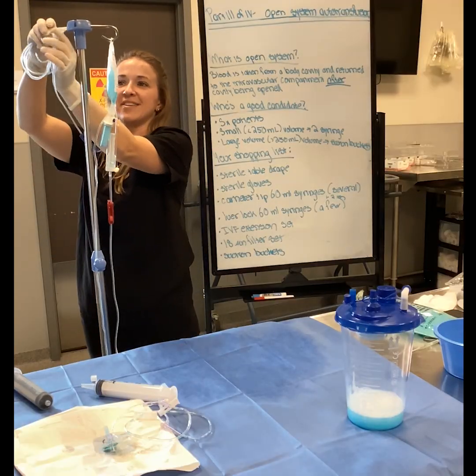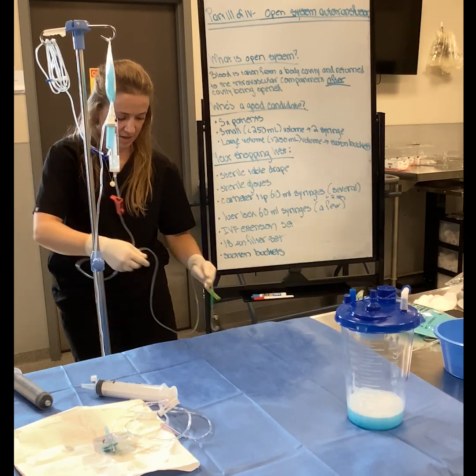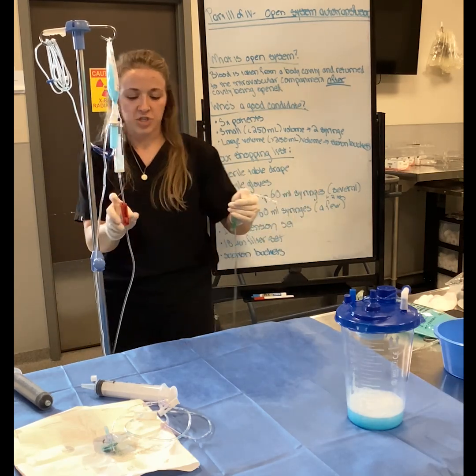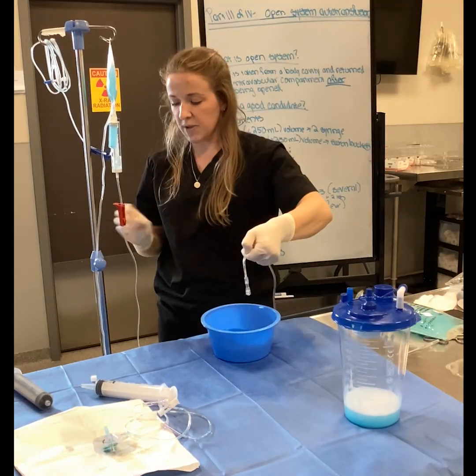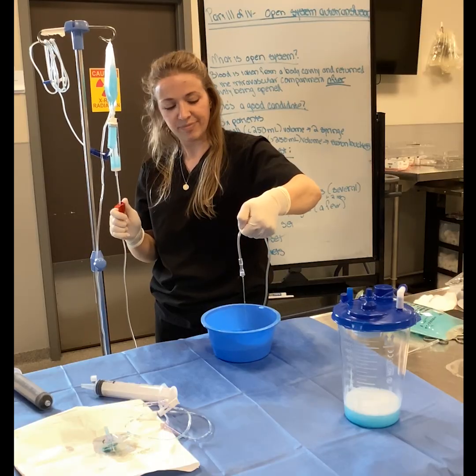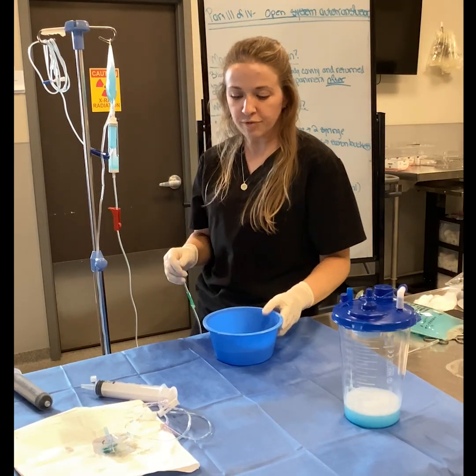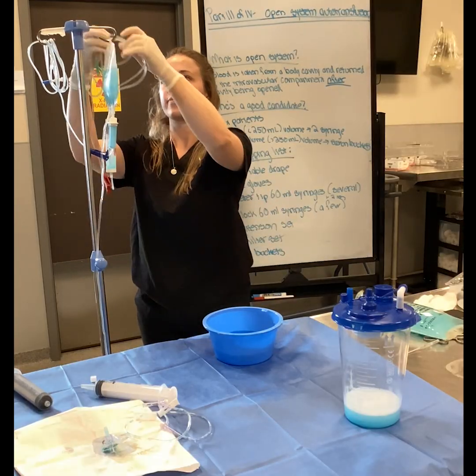I'm just gonna hang it because we don't need her anymore. And then the other side is the blood filtration set. So now at this point, all I would need to do is attach it to the patient's catheter and it starts dripping out again. And that's how you would do 2 different forms of open autotransfusion on surgical patients.